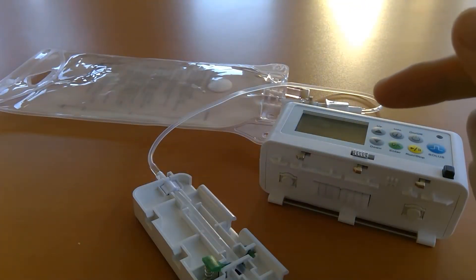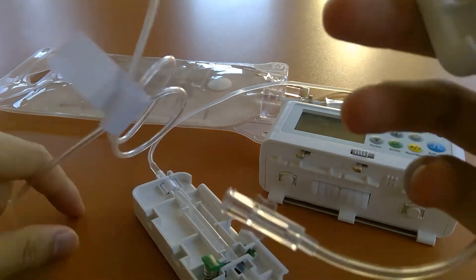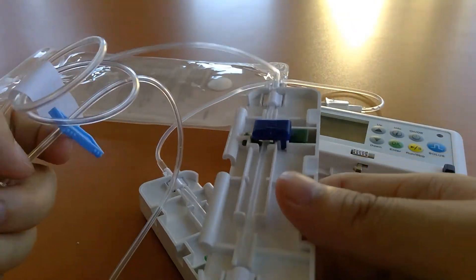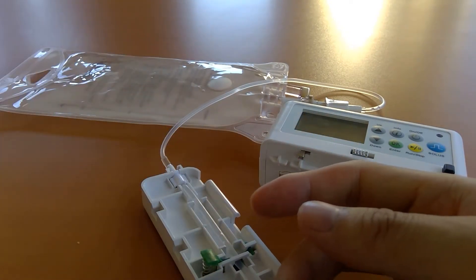We also have one more configuration, our HS003, which is simply a half set or pigtail adapter — just two luer locks, very basic. It clips onto the pump and you can piggyback off of a running infusion.